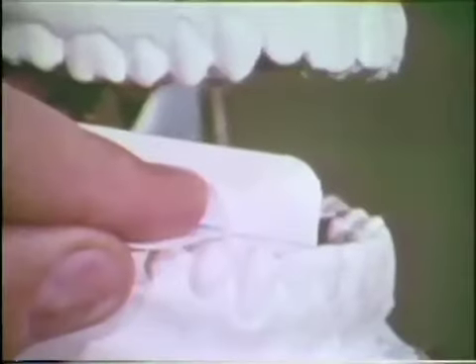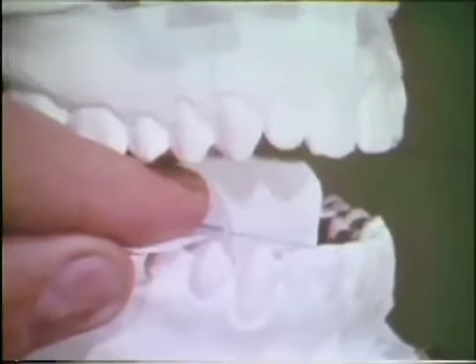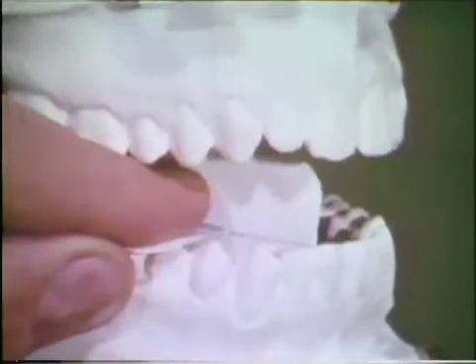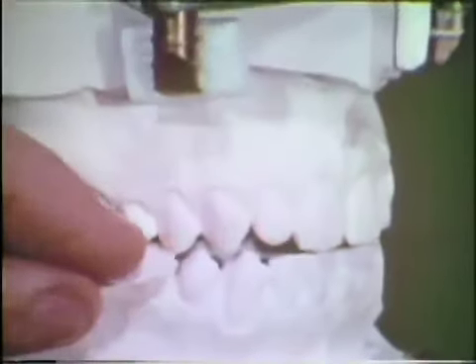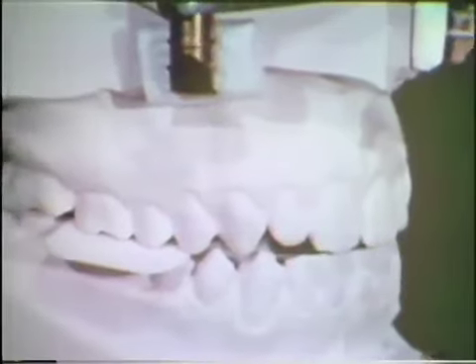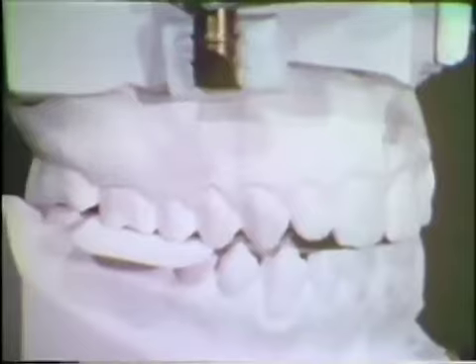With the film properly positioned, the patient is asked to slowly close. The examiner maintains the position of the packet with his index finger, carefully sliding it out of the way at the last possible moment. The packet position has been maintained, and the film would now be ready for exposure.